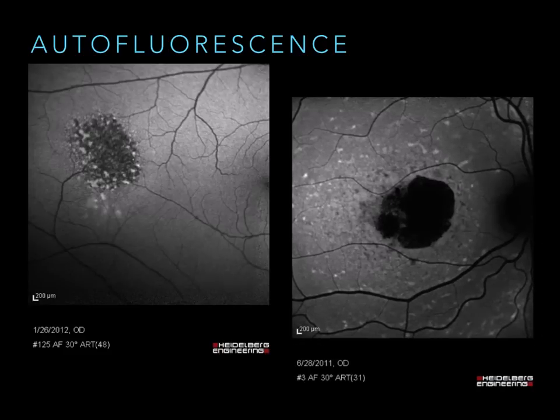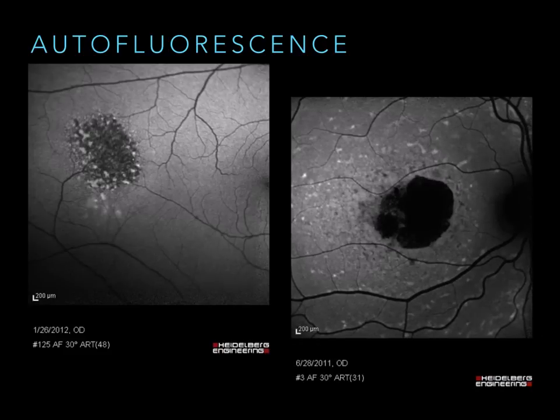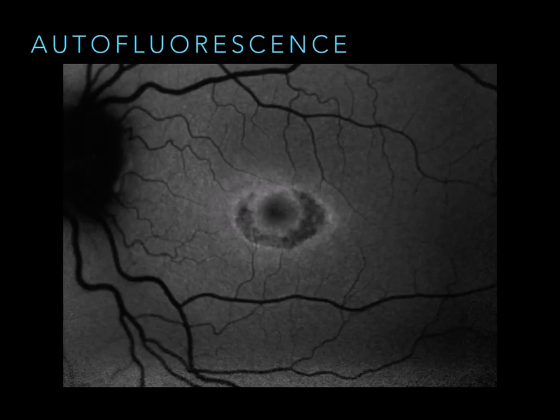That's hyperautofluorescing. And then this is a patient with, anybody want to guess? Brent? It's hypoautofluorescent in the center. So there's some kind of atrophy of the RPE there. We have multiple, I'll call them flecks, of hyperautofluorescent material outside of that. Like a pisciform, like a Stargardt. And let's see what's next.